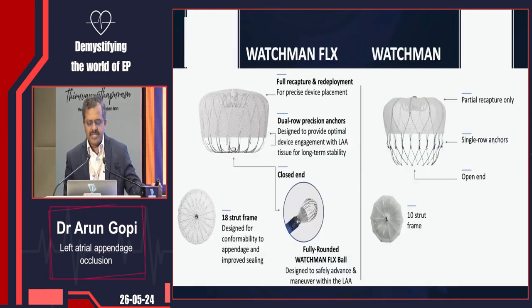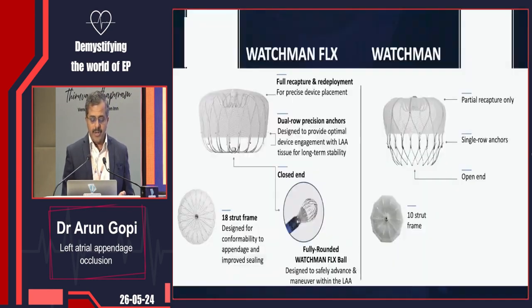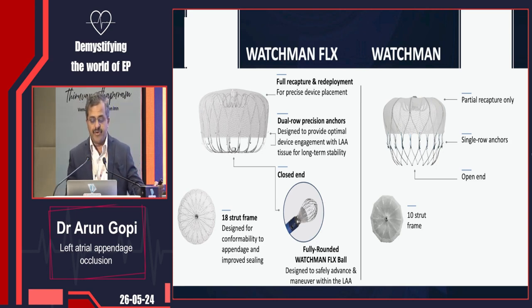The newer device is the Watchman Flex. The Watchman Flex, on the contrary, has a rounded tip, a closed ball, compared to the conventional Watchman, so it is actually quite safer. It has 18 strut frames, a dual precision anchor, and full ability to recapture and redeploy.